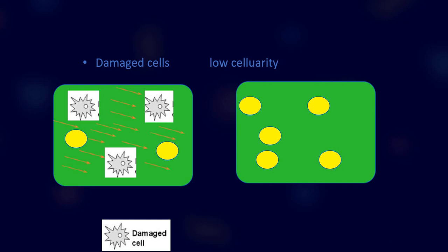On the other hand, diffusion will be more facilitated if the cells are damaged, as in necrotic tissue. Also in low grade tumors or benign tumors with low cellularity.